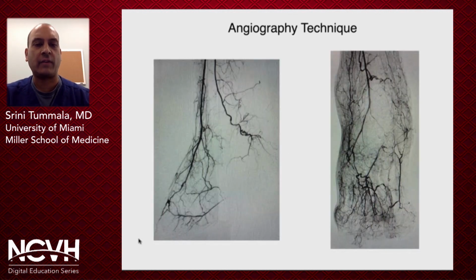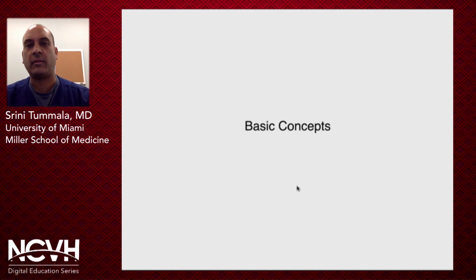And if you do proper angiography, hopefully you'll achieve angiograms like this. This is a case of mine. You can see I did an AP and lateral foot, and it really shows you what's going on. Here's your lateral plantar artery that just kind of dies out. So this gives me an idea that I'm going to have to tackle this posterior tibial common plantar, and then try to complete the loop in the lateral plantar artery.